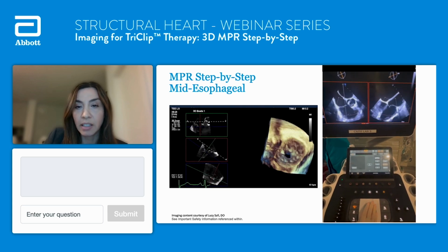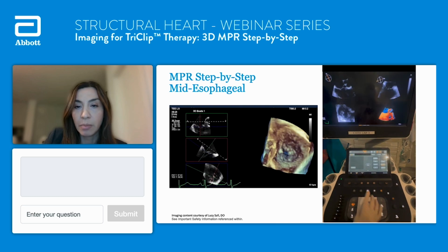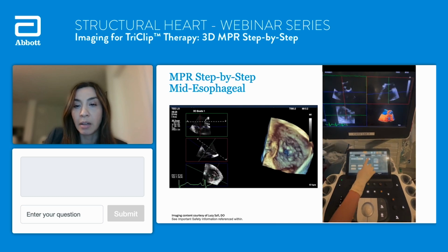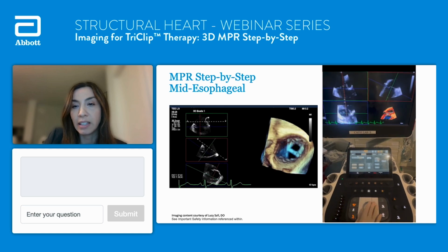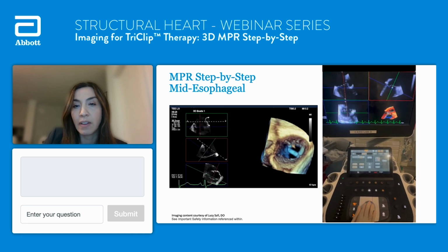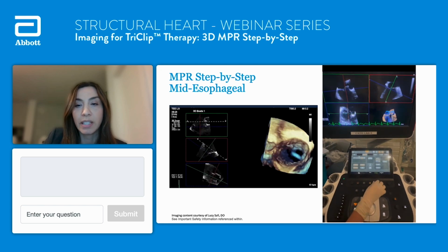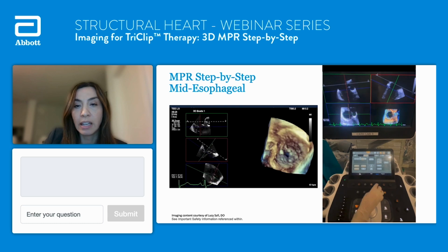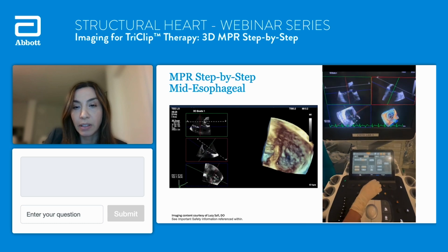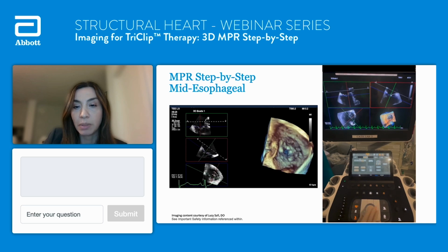Since that went fast, I'll let it play again. So 2D is obtained, a good 3D volume set. I immediately lock my planes. I rotate the blue line to be at the tricuspid annulus. And then in the green box, I orient my blue plane to be at the tricuspid valve leaflet tips. And then I can crop out anything I don't need and rotate my aorta to 5 o'clock, keeping my red plane perpendicular to the leaflet coaptation plane.